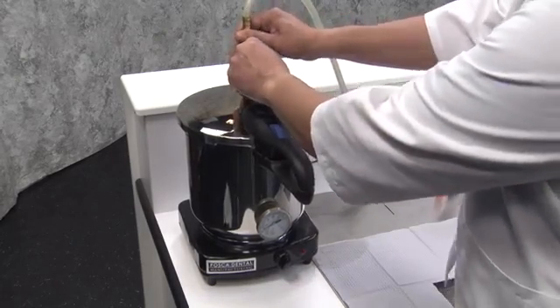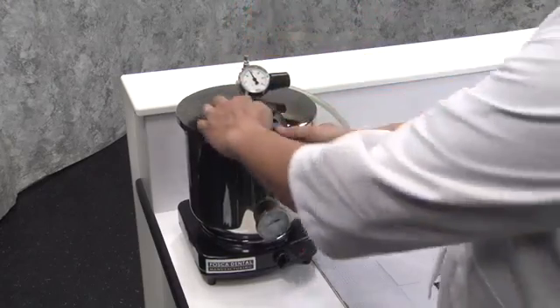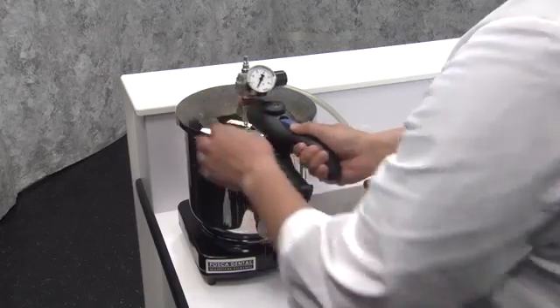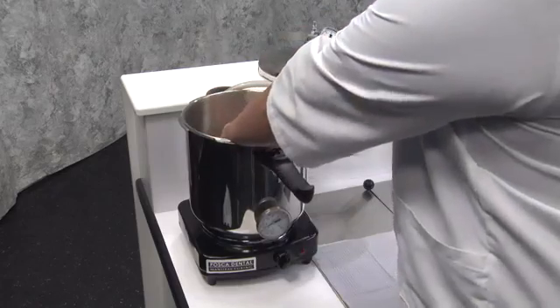After 2 minutes, remove the air hose from the pressure pot. Release the air by pressing the release valve. Open the lid and remove the models.